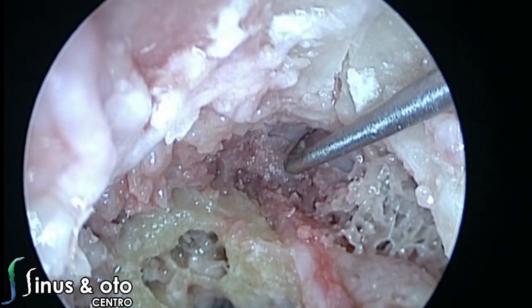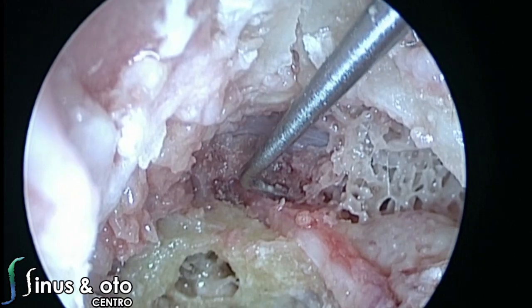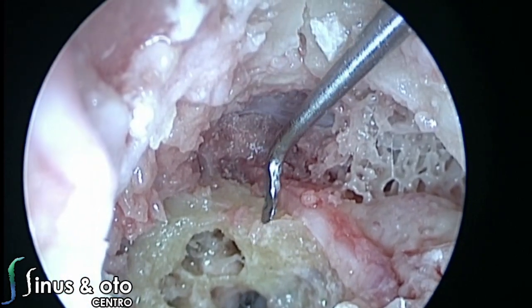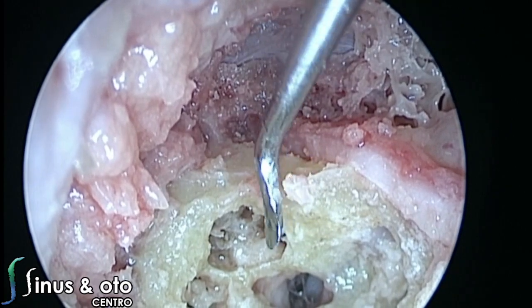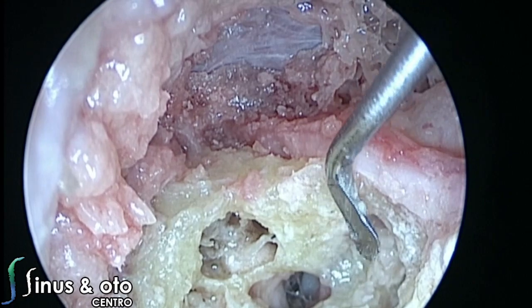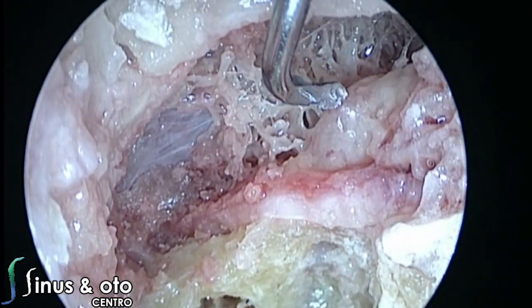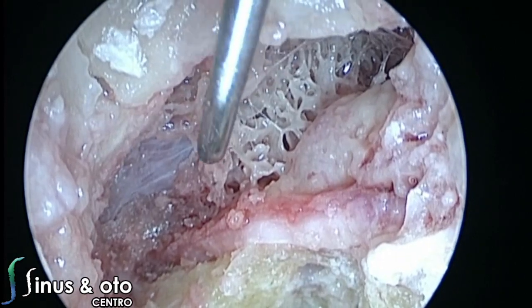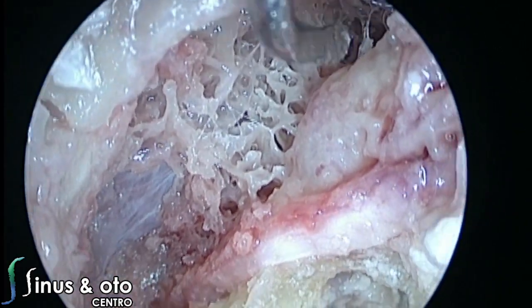And now also we can understand the relationship between these structures and also the relationship between the inner ear, the facial nerve going in this position, the labyrinthine, the cochlear nerve goes to the modiolus, and the superior and the inferior vestibular nerves going to its attachment, which are the elliptical recess and the spherical recess, a lateral semicircular canal, the cog, which was over there, the aditus ad antrum and the antrum of the mastoid.